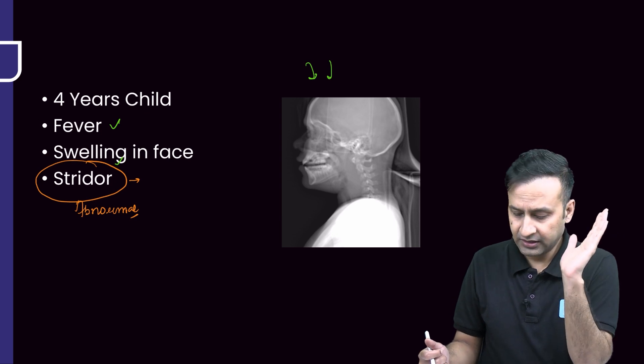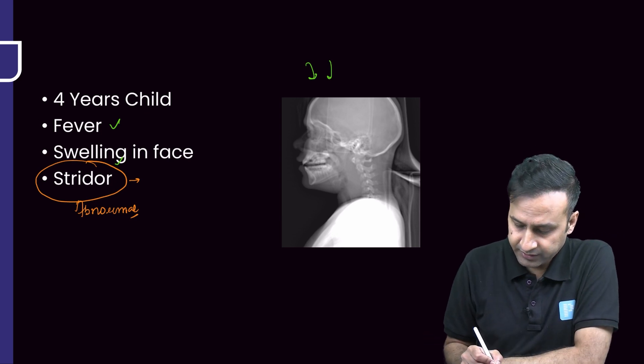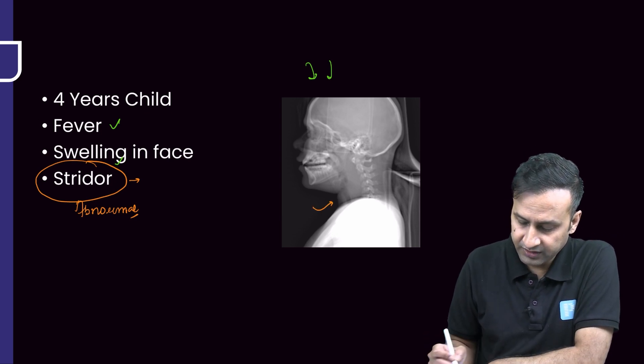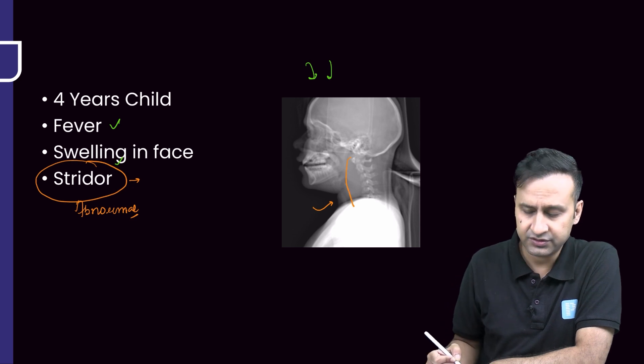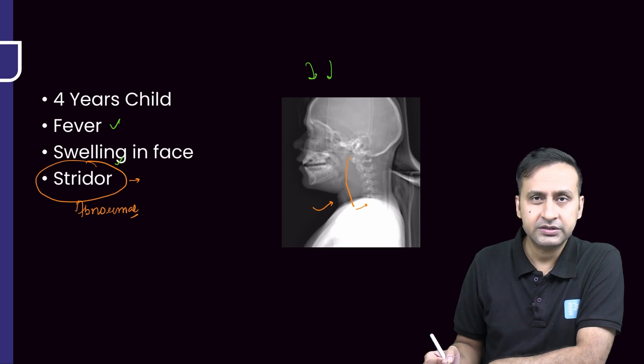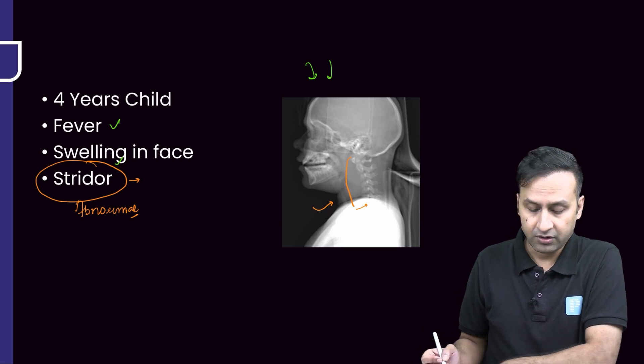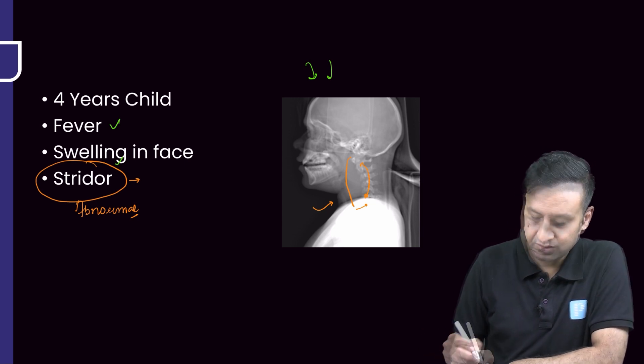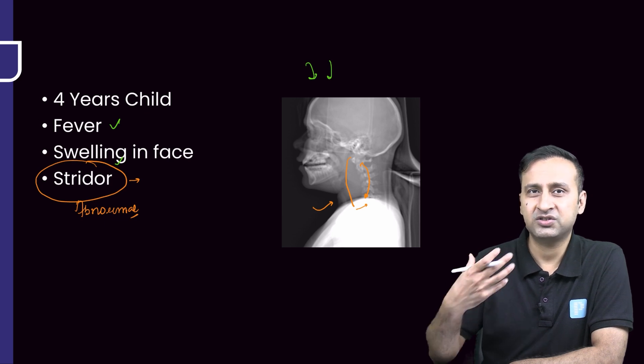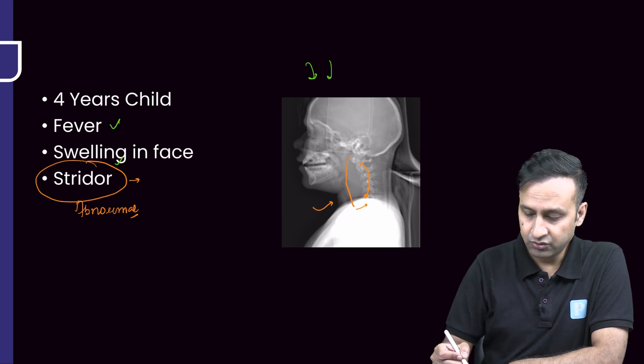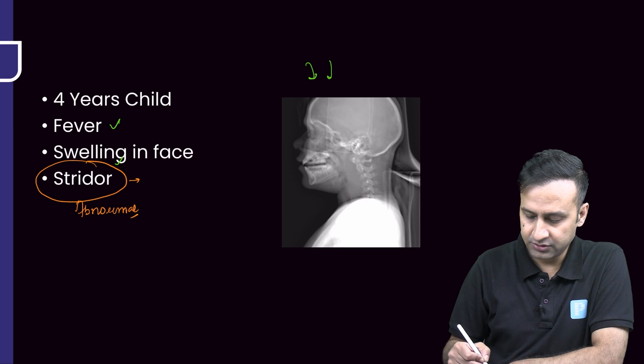Let's look at this particular radiograph. We can see there is increased prevertebral soft tissue thickness extending from C1 level up to the C6 level. You can also see the curvature of the spine is more concave, as if something is pushing the spine posteriorly.